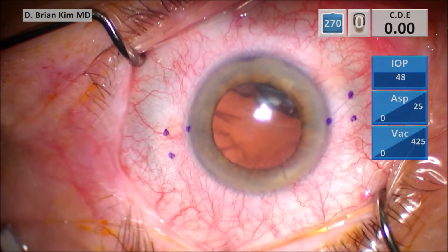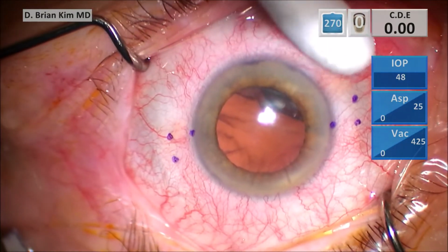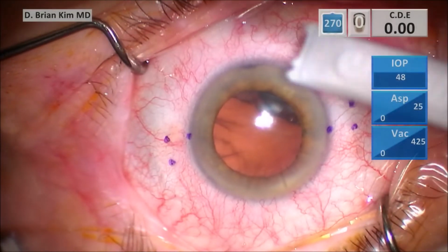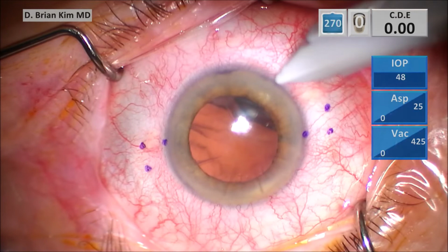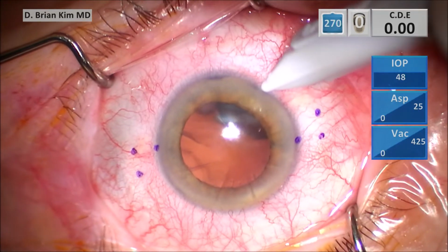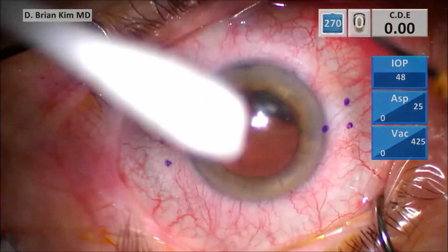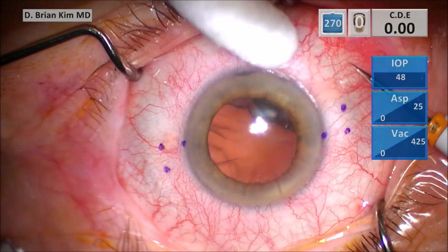And by having a more discrete mark, you'll be able to see the needle more clearly when you're trying to tunnel through the sclera. So I've made my marks, and this is the trocar. I'm going to indent 4 millimeters posterior, but look what I'm doing. I'm making the mark for the trocar right over the area of dislocation. So I know where those zonules are. They're just anterior to that mark.